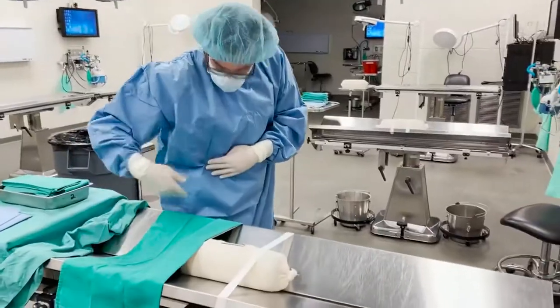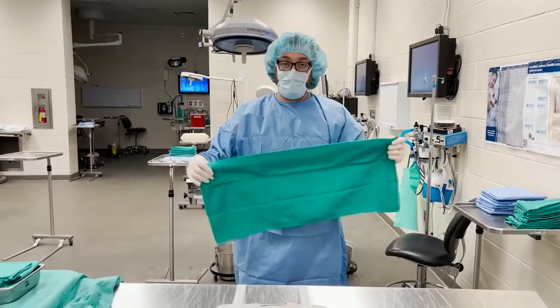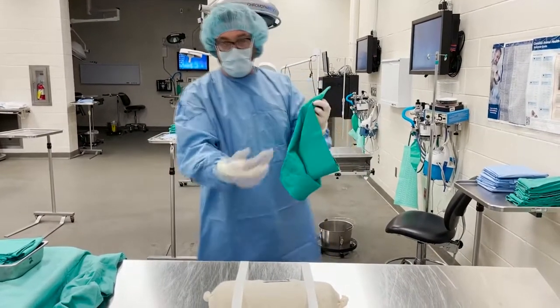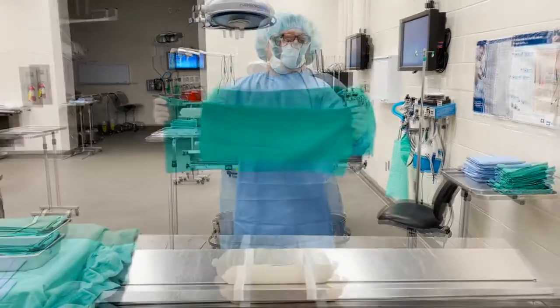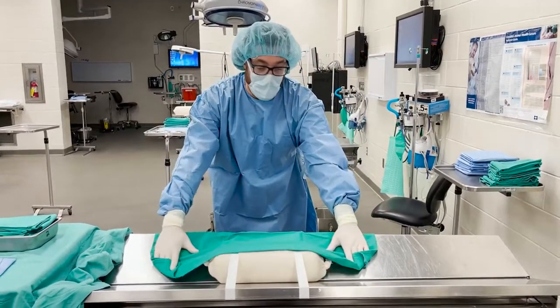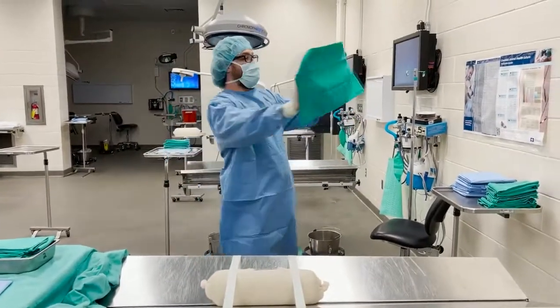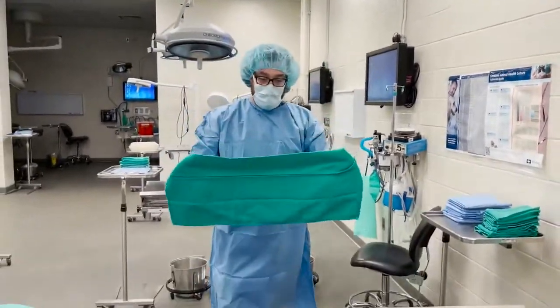Just be sure to keep distance between your hips and the table. Another common place to break sterility is fingers and hands, which is why we teach you to fold and place these towels in a very specific way. We want to make sure our hands or fingers are never directly between the non-sterile field and our towels. That's why when we hold the towel, we hold it such that our hands are completely covered — you can't see them at all.